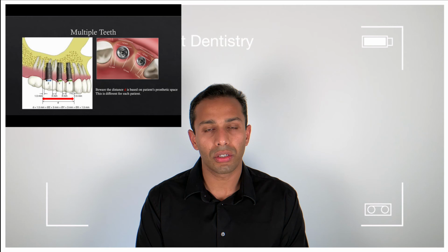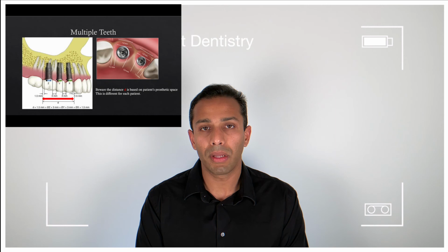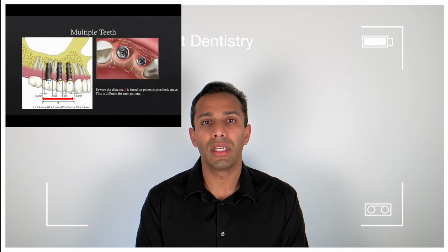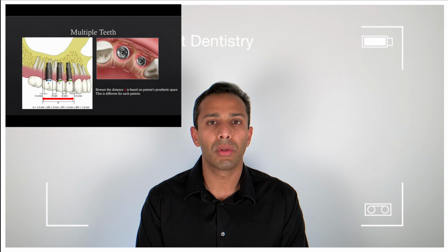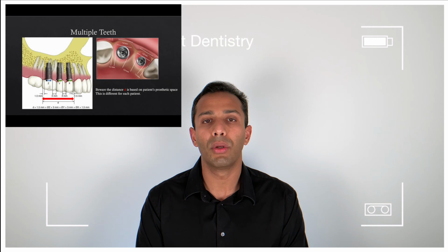When an implant is lodged into the jawbone, it needs to have enough bone housing around it. From a lot of studies done by very smart people in the field, you need to have at least 1.5 millimeters of jawbone around the implant towards a neighboring tooth. 3 millimeters between an implant and an implant, but usually 1.5 millimeters between an implant and adjacent teeth. Now, you need to have 1.5 to 1.8 millimeters of jawbone between the implant and the side of the bone towards the cheek and the tongue.